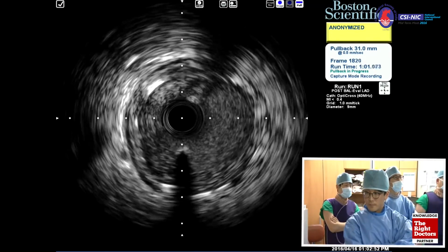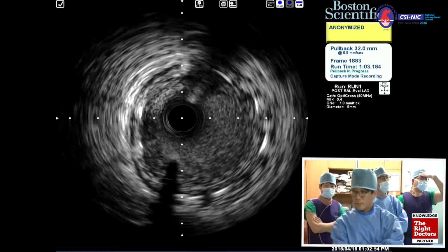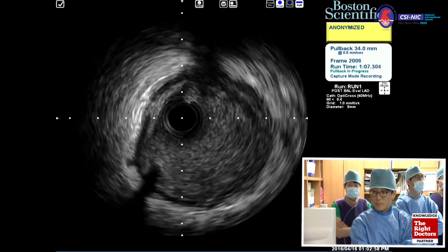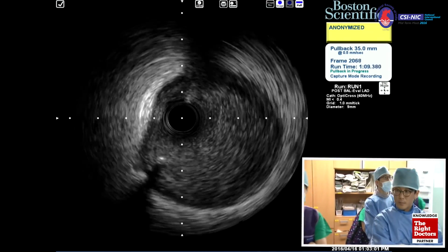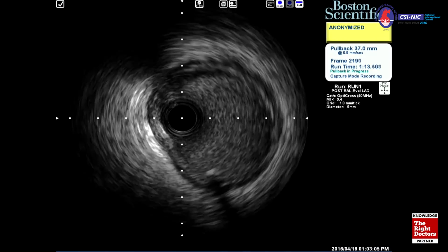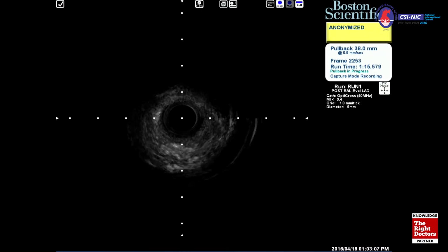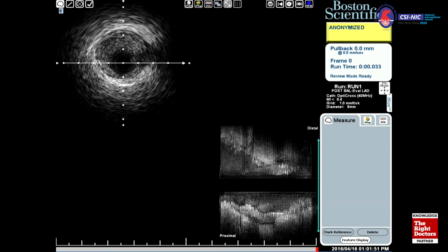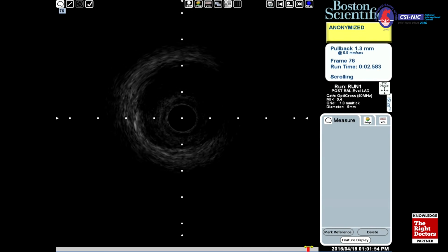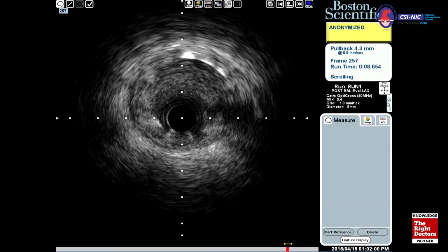Proximal part, almost stent diameter is 4 and 4.5. Okay, this is the main ostium. Right, the very proximal shaft over the main is free of disease. Would you show us again the distal part of the LAD? We want to have some more ideas.